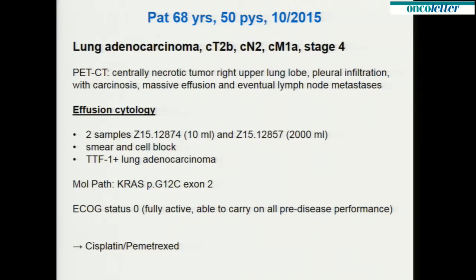And then we always do a smear. We have 3 smears. The problem is that you have only 3 smears, so you can't do much on this. That's why we established an alternative method 10 years ago, which is called cell block. The cells can also be clotted into a cell block, and a cell block can be cut. You can make 100 cuts for all the relevant markers.